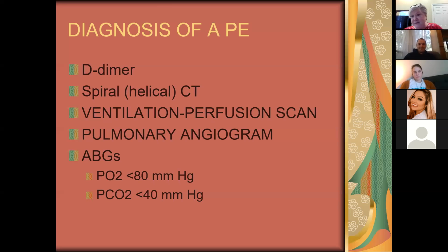Now, they may have a helical CT now, because this was probably somewhere between 5 and 10 years ago. But don't think that you have to be in some Band-Aid station out in the boondocks. This was part of CMC's network, and they did not have a helical CT at that time down in Pineville. So I don't want you to think that everybody has a helical CT, because they don't. So it's kind of interesting.